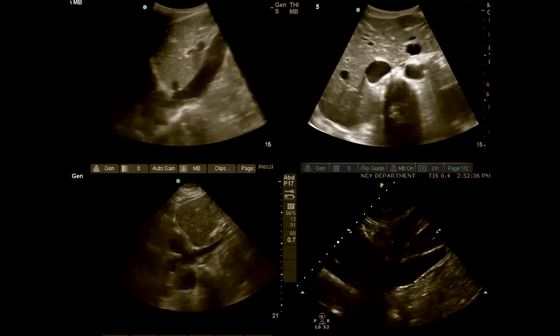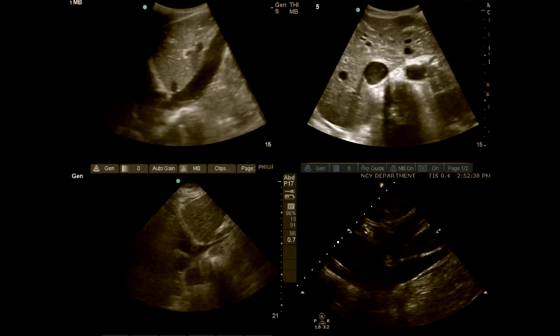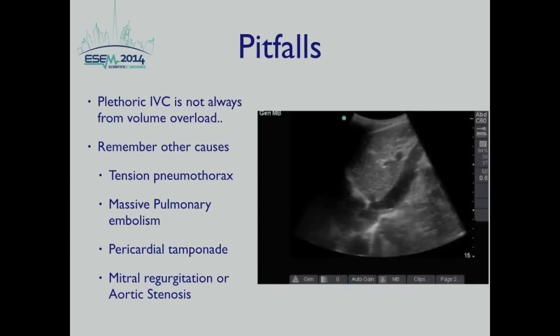Using the IVC to evaluate volume responsiveness is a great additional tool — it is fast, reliable, reproducible, and non-invasive. When the IVC is small in diameter and collapsed, giving fluids is the way to go. However, you must understand the limitation: a distended, non-collapsible IVC does not rule out fluid responsiveness. Some important pitfalls: a plethoric IVC is not always from volume overload. There are other causes for distended IVC, including tension pneumothorax, massive pulmonary embolism, pericardial tamponade, and mitral regurgitation or aortic stenosis.